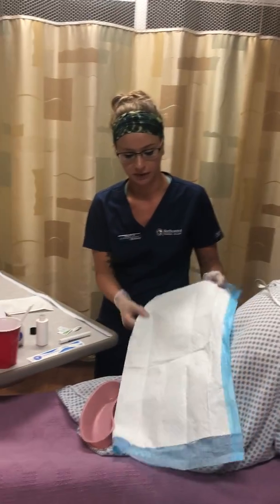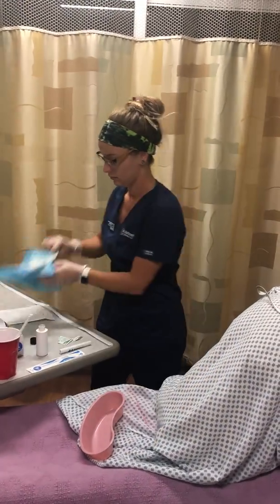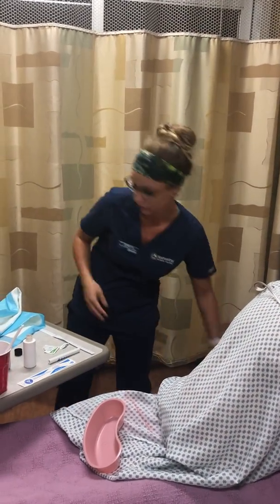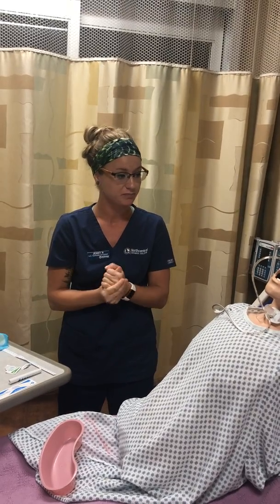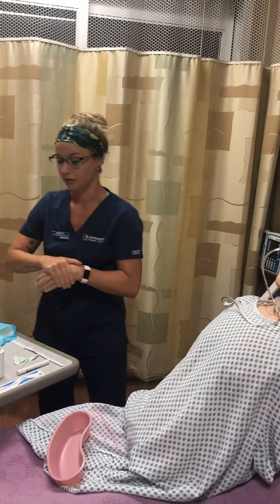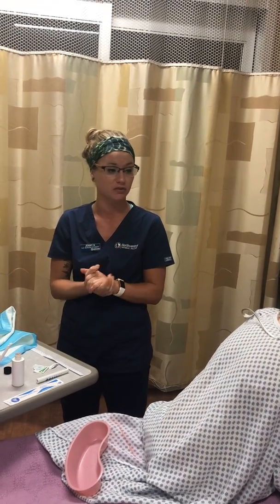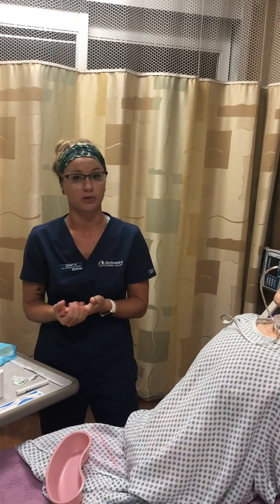I will clean up my supplies, throw things away. I'm going to wash my hands. And I would ensure safety, make sure my client has her call light, bed is in the low position. And I would also make sure to document the type of NG tube used, the size of the tube, how the patient tolerated it, any assessment findings, and if you aspirated some gastric contents, maybe the color and the amount.